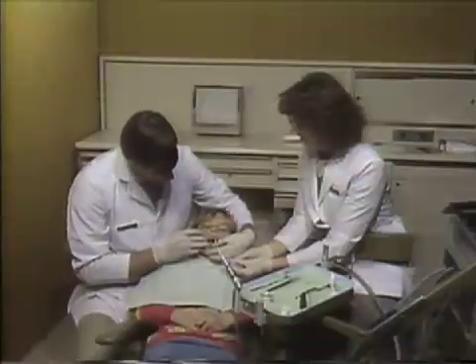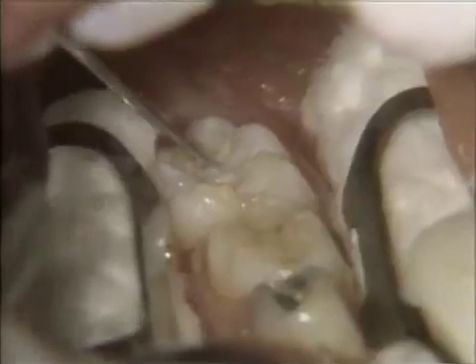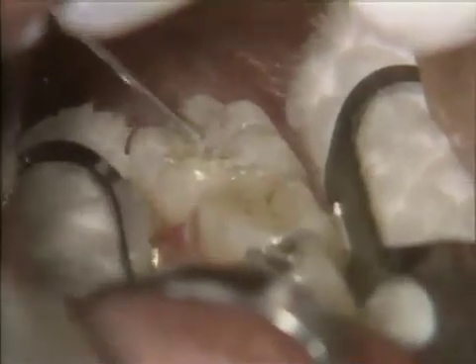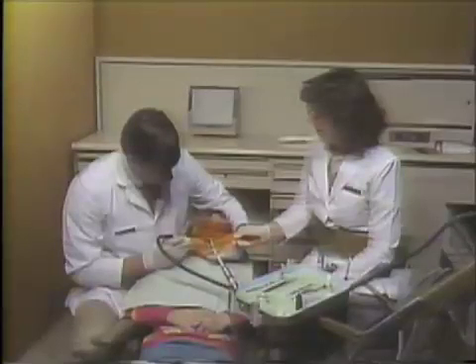The sealant material is then applied to the tooth surface using the chosen delivery system. A DICAL applicator, which is similar to a ball burnisher, is being used here to apply an opaque, filled sealant. Small increments of sealant are brought to the tooth until all pits and fissures are covered. The sealant will be cured by visible light polymerization. A protective shield is being used during polymerization. The tip of the light should be held close to the tooth to ensure optimal polymerization. Manufacturer's specifications should be followed for determining the length of polymerization time.